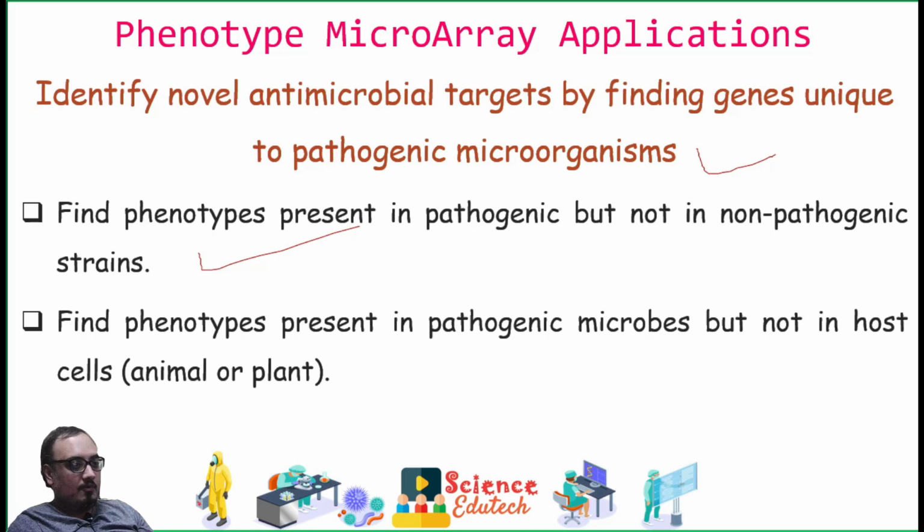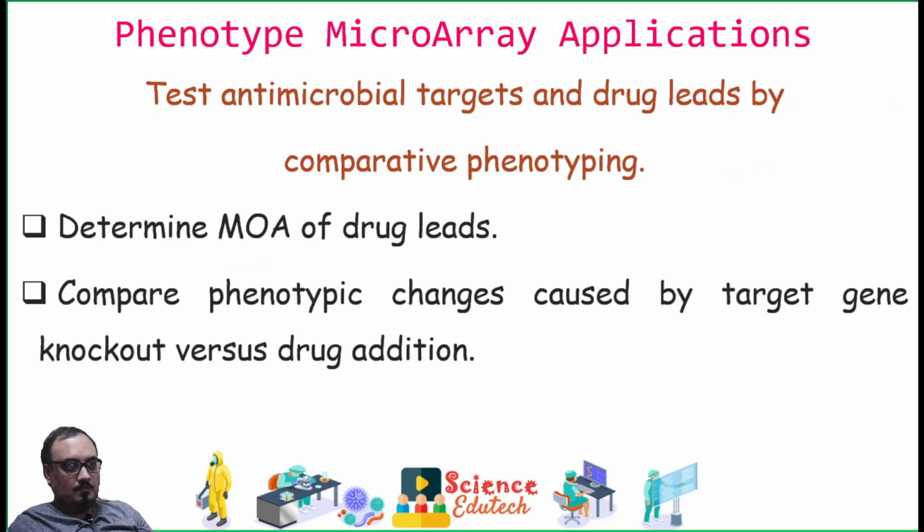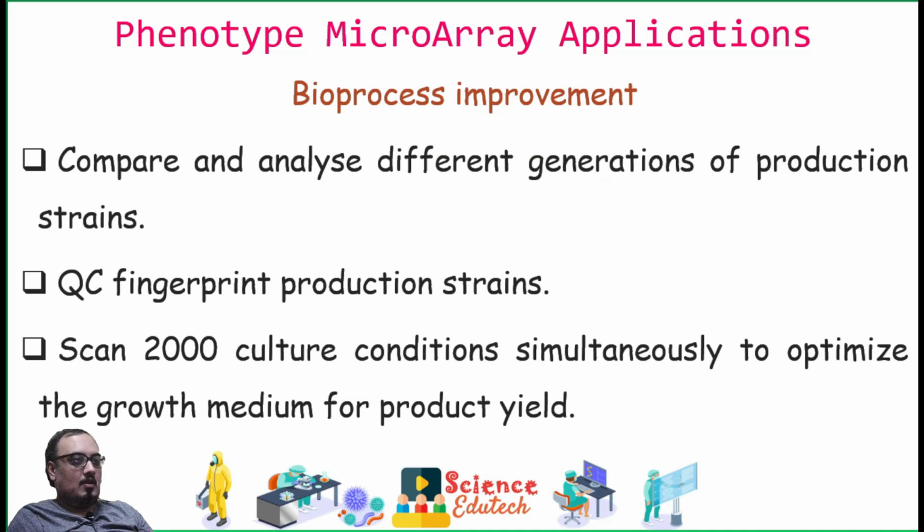Also find phenotypes present in pathogenic microbes but not in host cells. Test antimicrobial targets and drug leads by comparative phenotyping, determine the mechanism of action of drug leads, and compare the phenotypic changes caused by target gene knockout versus the drug addition.